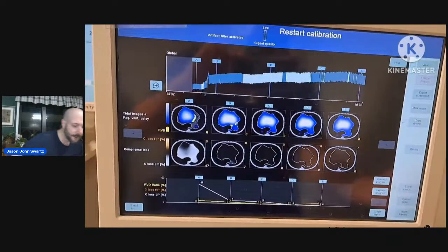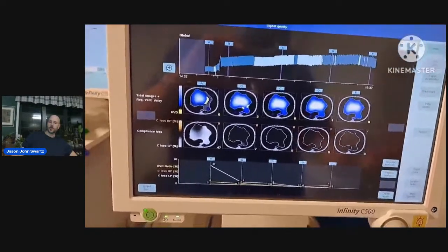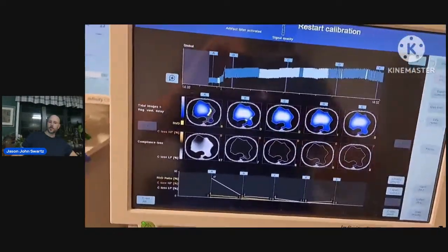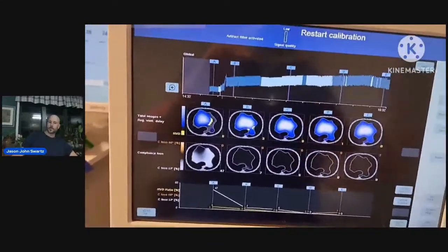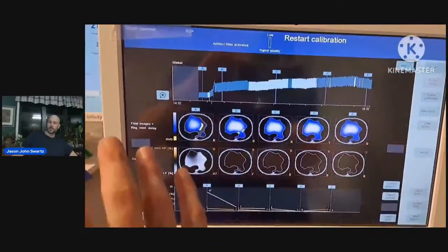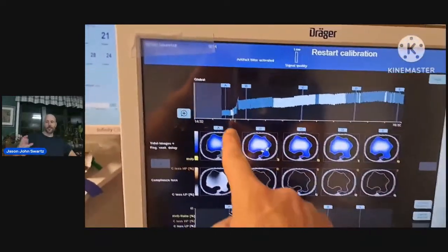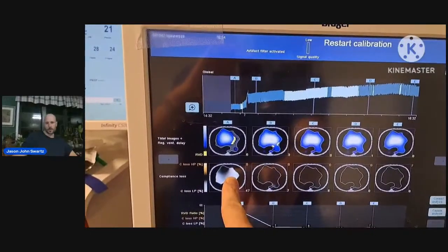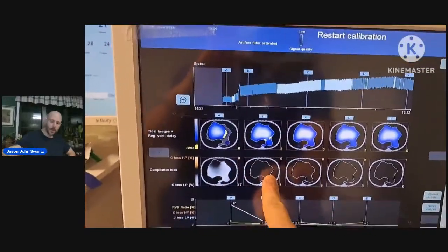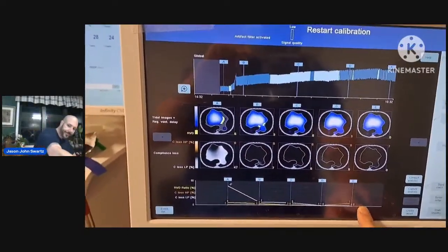So it's like, yeah, sure, the FiO2 is 50%, the tidal volumes are not too bad, but we had no idea before putting this on that there was total de-recruitment. Here, the minute we transitioned from pressure support to APRV, you see all of a sudden zero atelectasis.